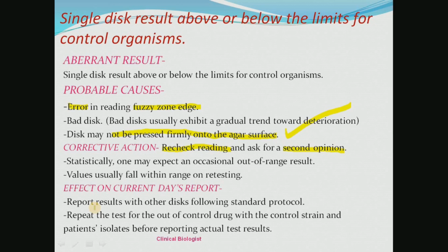According to your protocol, release those results, but repeat the test with the control disc, control drug and control strain, and also with the patient isolate, before reporting the single disc result. Remember this one: this is the corrective action for a single disc result.